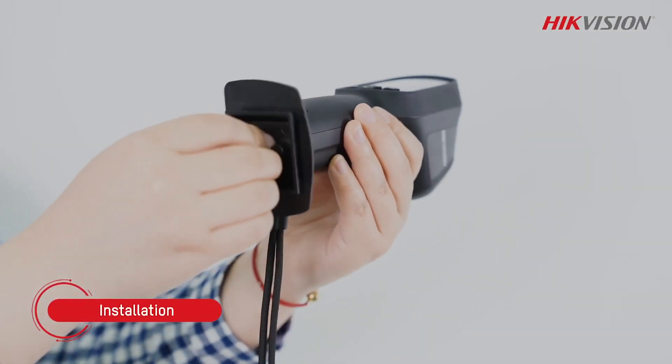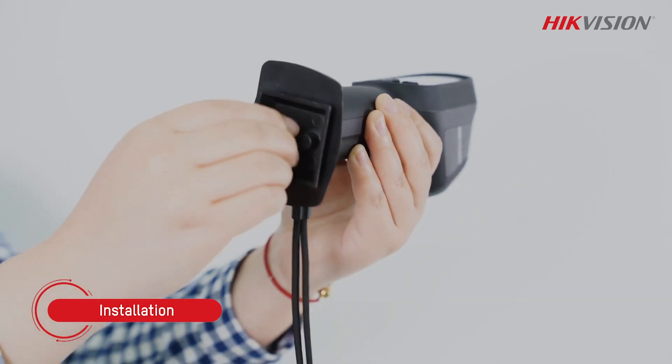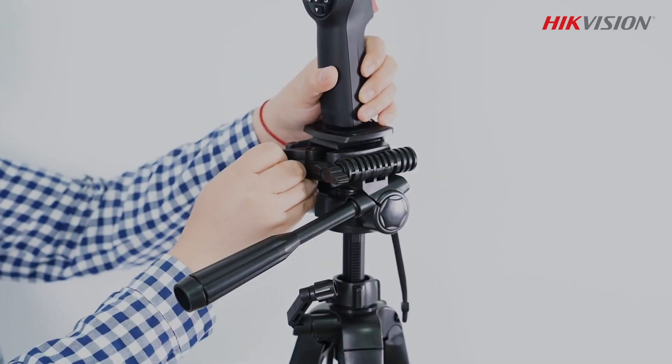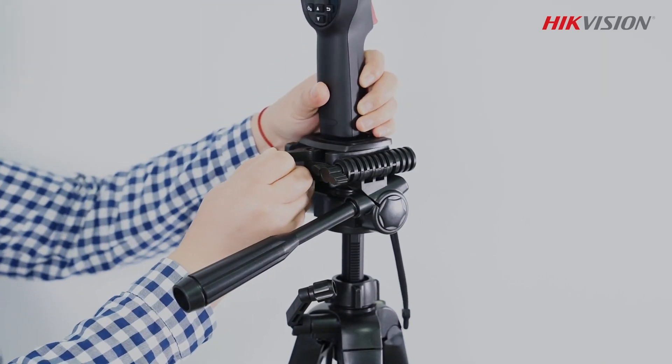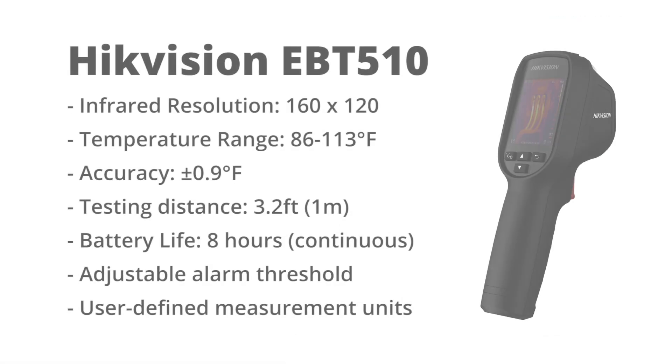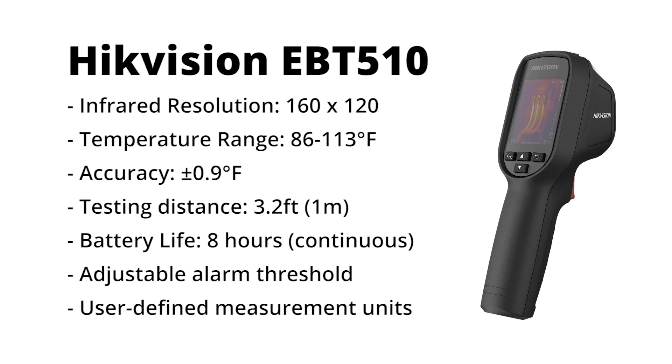In that example, the EBT-510 was handheld, but it can also be mounted to a tripod. This is another big advantage over infrared thermometers. Please note that a tripod is not included. The EBT-510 offers high accuracy over a temperature range of 86 to 113 degrees Fahrenheit, an ideal range for body temperature screening.